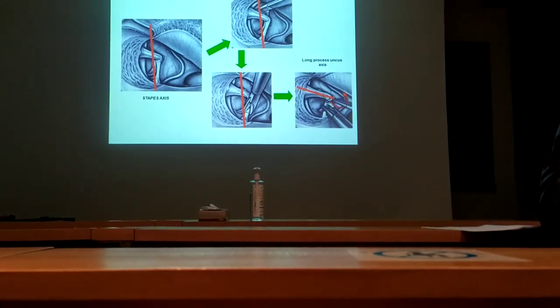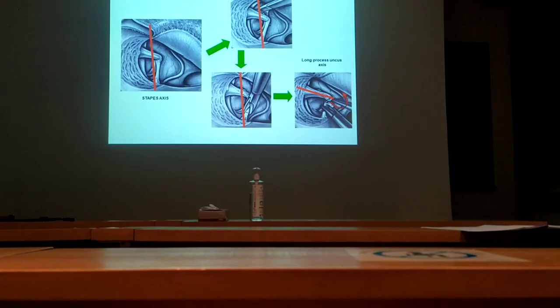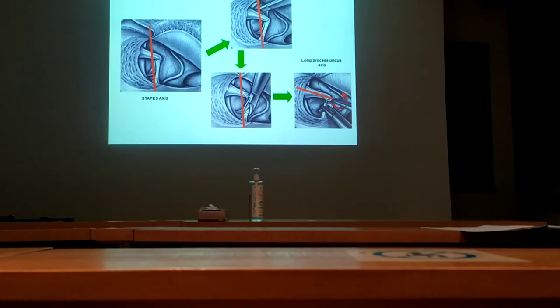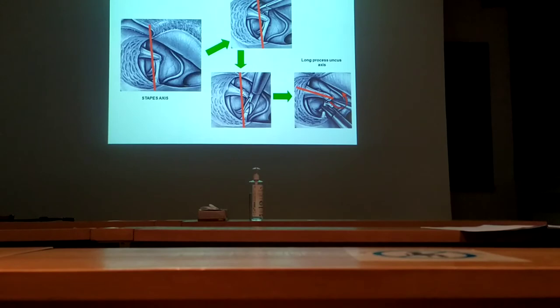And to remove the superstructure, in the way of the long process of the incus. You see? In this way. Because you move, you don't lose the state of the incus. If you try to remove the superstructure in the other way, you can move the long process of the incus, so you can move the anterior position of the articulation between the malleus and the incus.